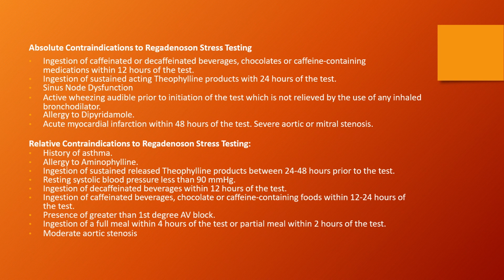Now, all of the rubidium tests are done using pharmacologic stress testing. Because of the short half-life of the rubidium, patients cannot walk on the treadmill.